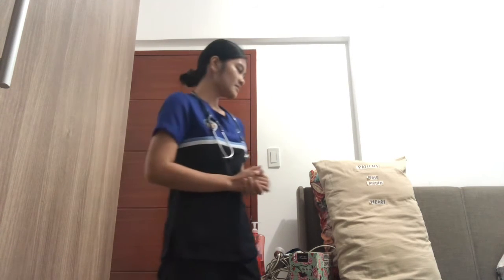But before that, we should instruct the patient first that in the middle of the medication, the patient should do several deep breaths in order for the medication to go to all parts of the lungs and to be more effective.